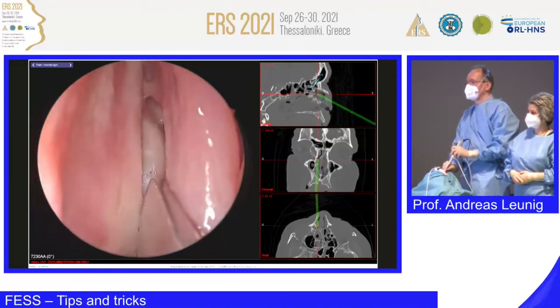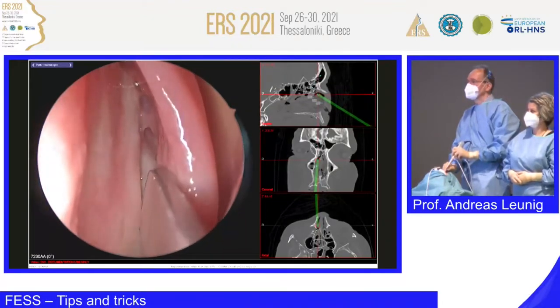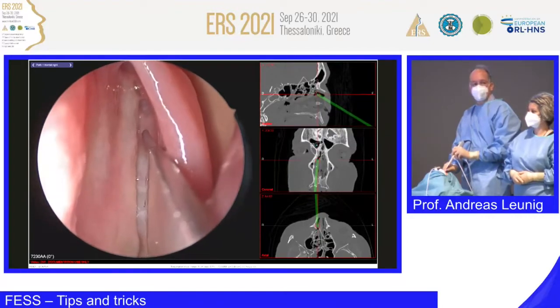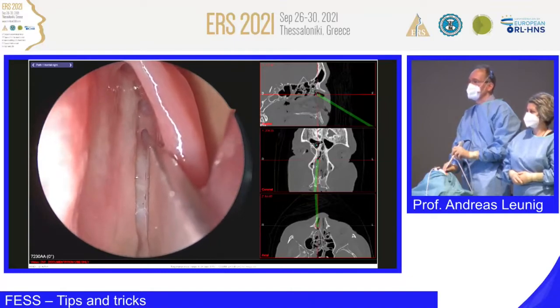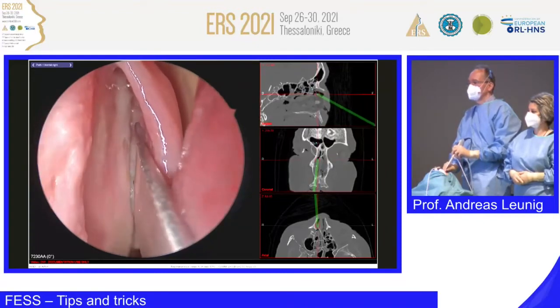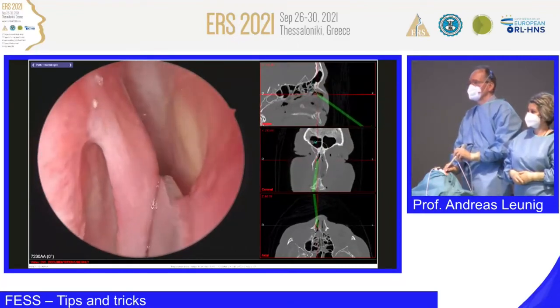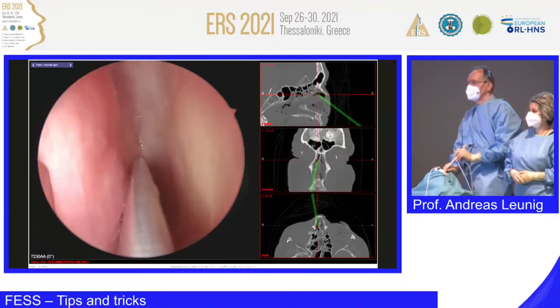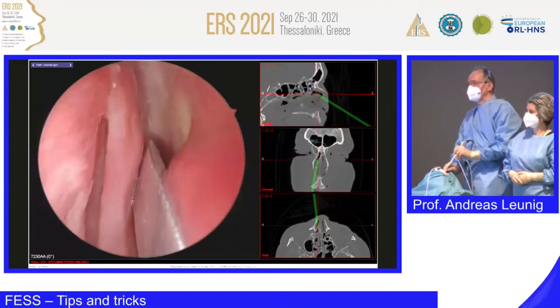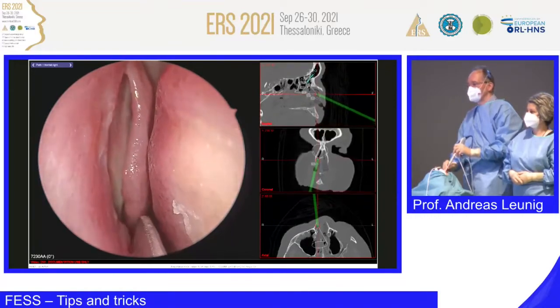Now, looking a little bit higher up, we are looking in the direction of the frontal recess. And the frontal recess, there are some opening clefts. So maybe one of these is entering up into the frontal sinus. We will see later on as well about the attachment of the uncinate process here cranially. So, and then position number three would be, you're looking very high up into the olfactory cleft here, and you can look here if there are any polyps, any tumors, any pathology. And this is a systematic nasal endoscopy which should be performed in every patient.